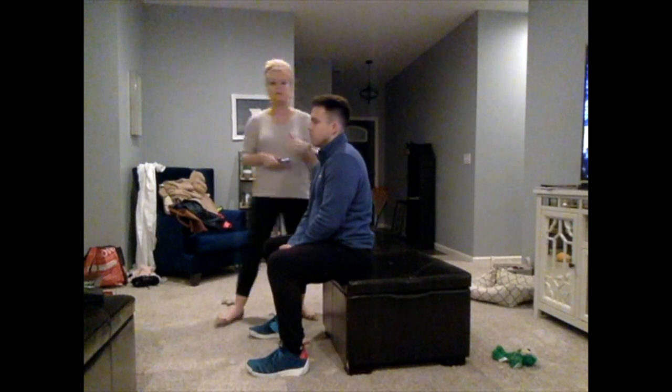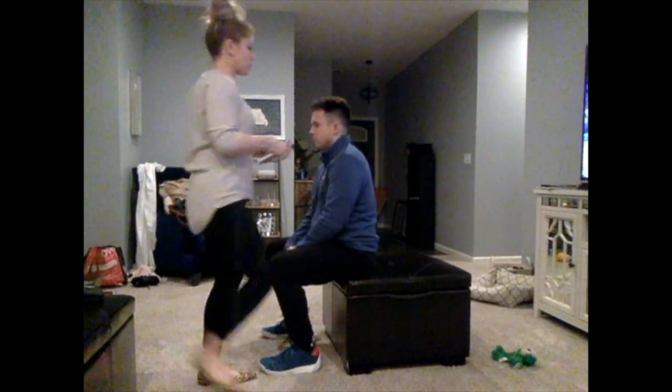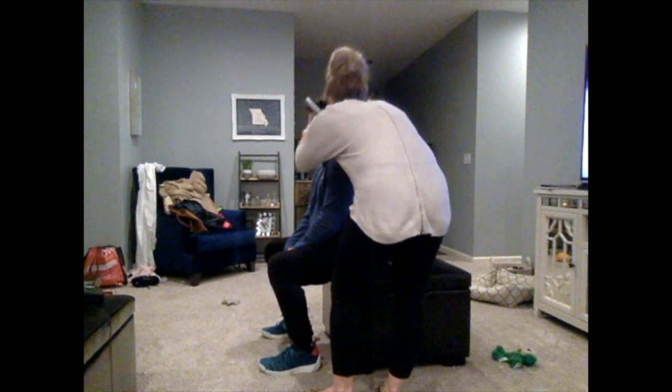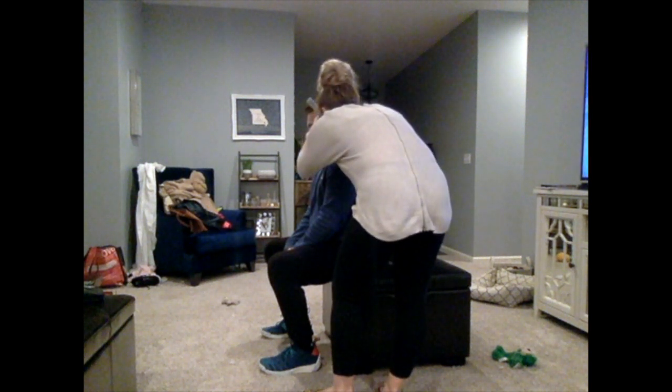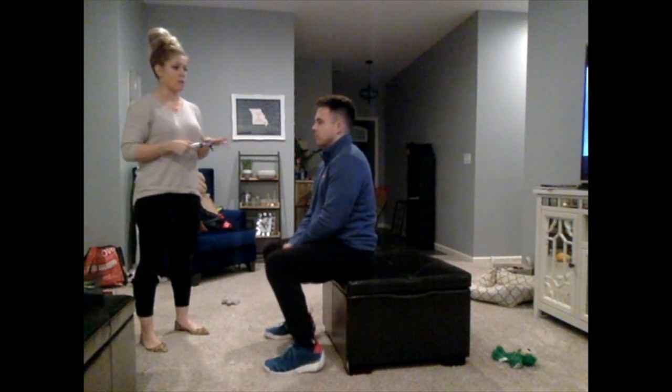I'm looking for a nice pearly white color, and his coloring is great. Pulling it up and back. Great. So I also was looking at the bony prominences, the malleus, the umbo, and just looking again, seeing if there is any redness.